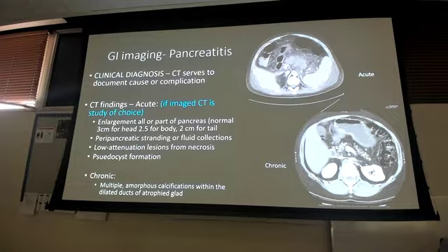Ma'am. Will you be able to, because I have a hard time trying to distinguish the atelectasis and the silhouette sign. They all look very similar to me, especially when it's on the lower lobe.